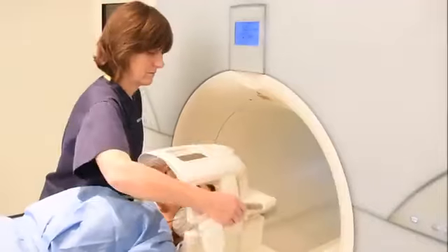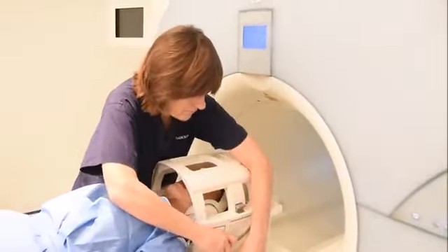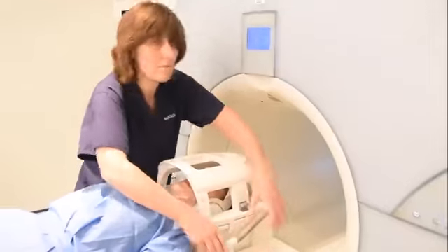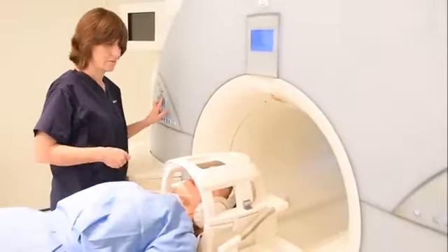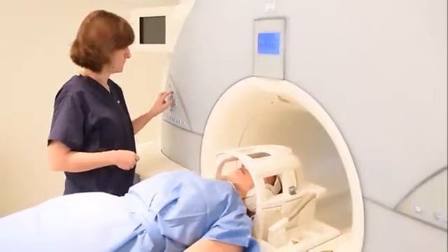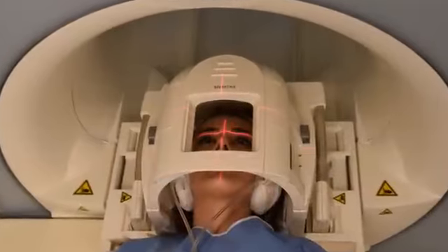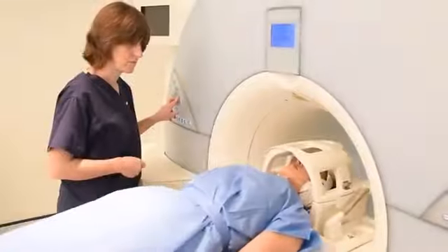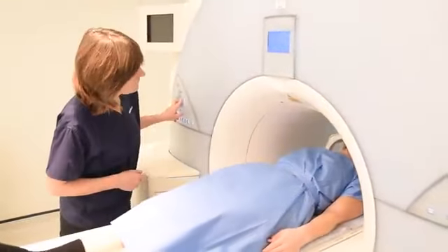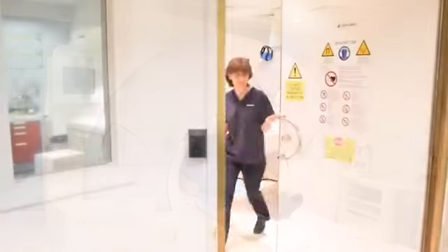And put the head coil in place. Center to the glabella and move the patient carefully into the scanner. Make sure they're calm and comfortable before you leave the room.